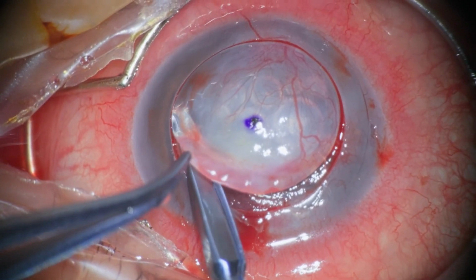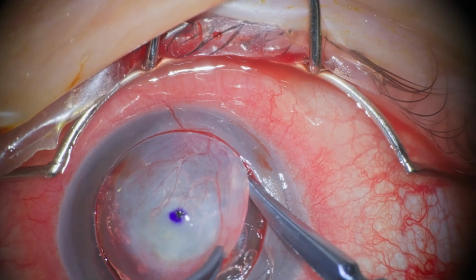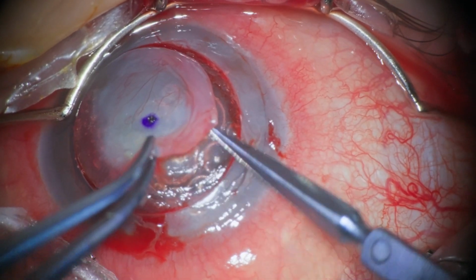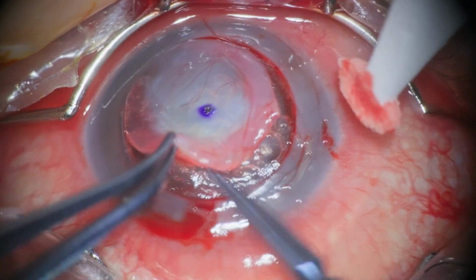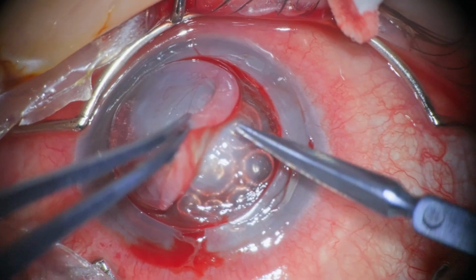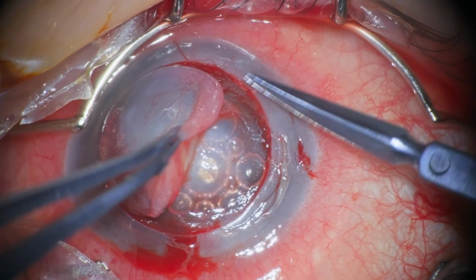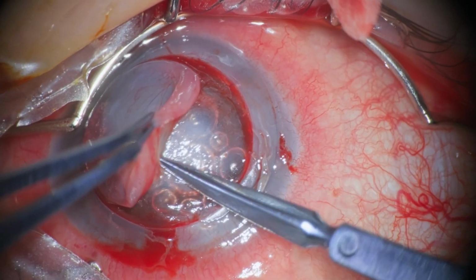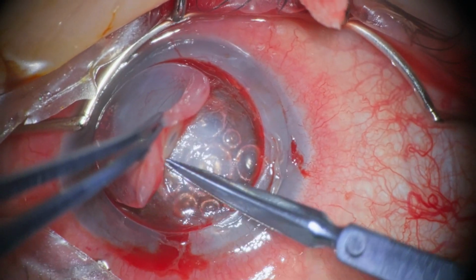Microperforations are sometimes inevitable in scarred corneas, but that's just part of life when doing DALK. We're taking off the bulk of the cornea, and using the Vannas scissors simply to forcefully, bluntly dissect the scar tissue.